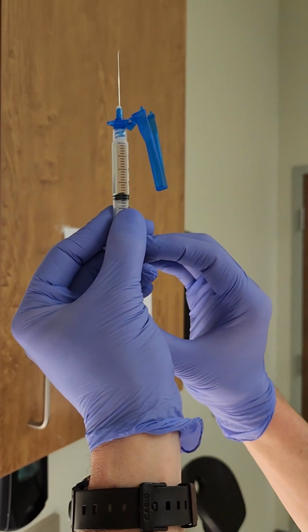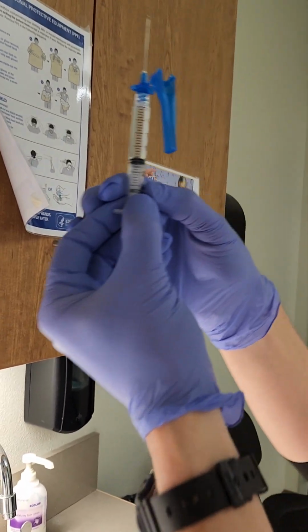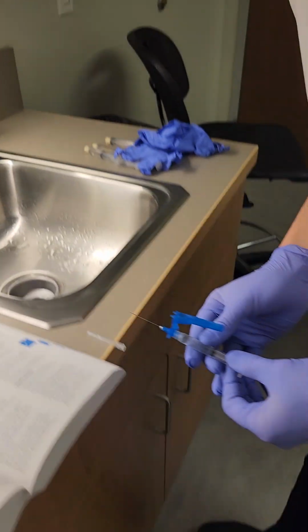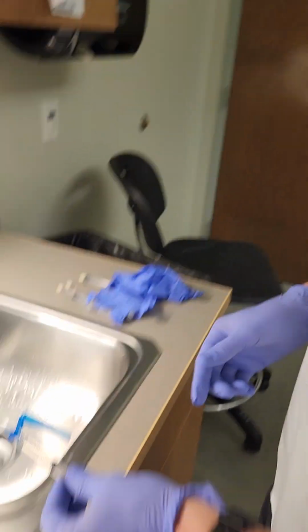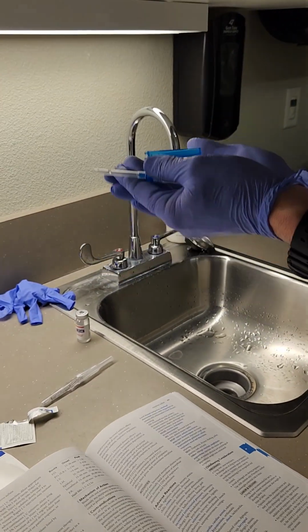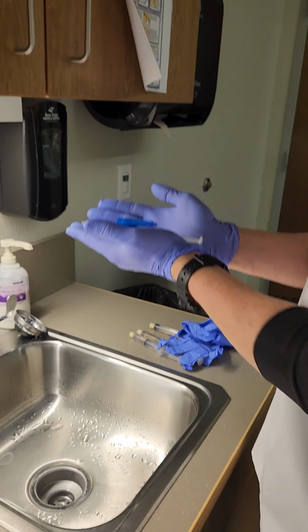I think I want to get just a smidge more. Well, nurse, is that 2? Yep. Cool. Perfect. Thanks, man. My pleasure. Safety first. All right, so now I'm going to place this in my little transportation container that I can walk through the halls with.